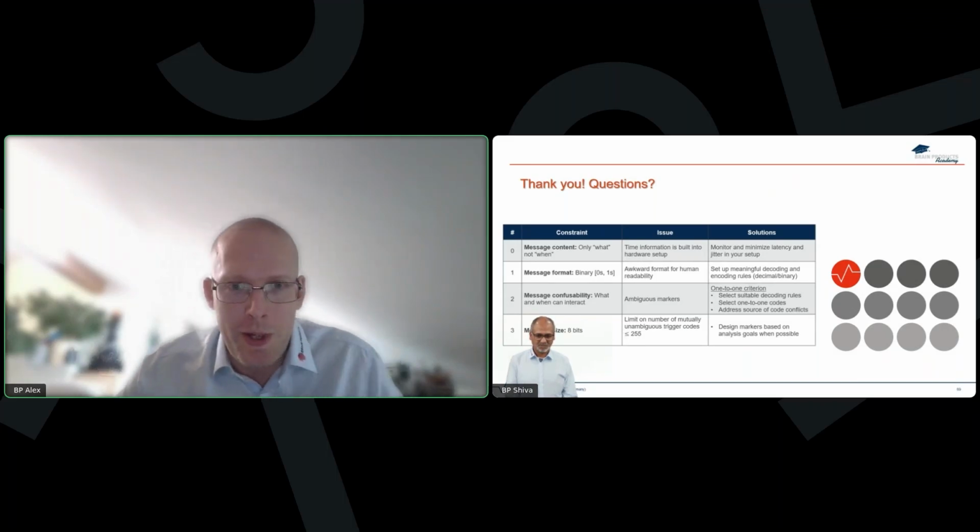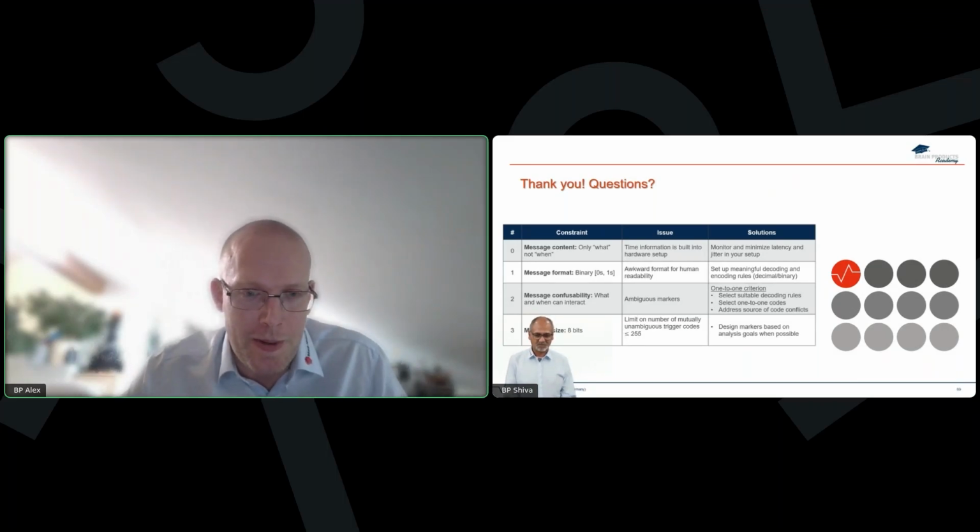So it is always good to check this with a true event or link different events that are happening at the same time. And that is explained in the press release, the timing verification test that is linked in the materials. And of course, if you have any question regarding this, we are happy to answer them and send you emails. So please don't hesitate to ask.